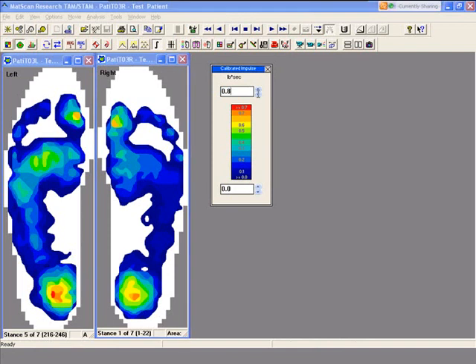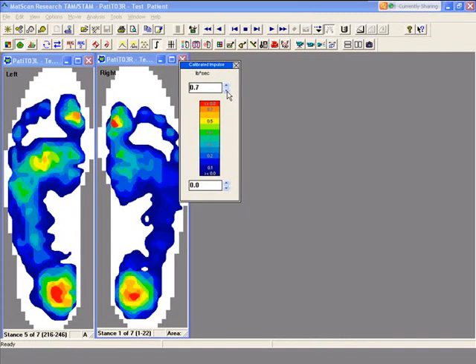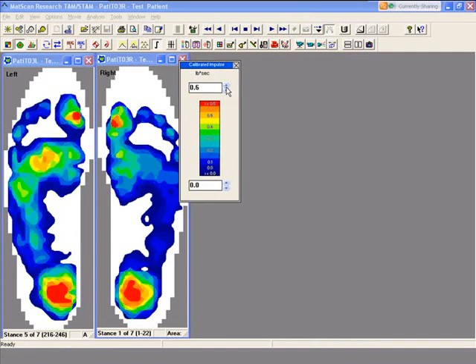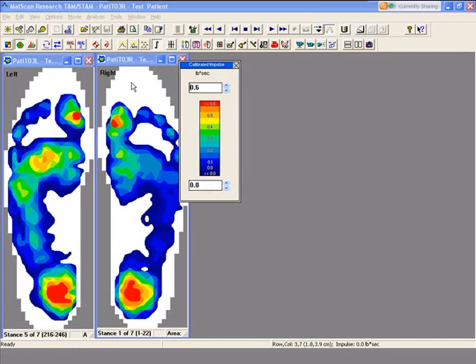This is showing you the areas that the subject spends the most time on. You can see that the subject spends a lot of time on the heel as well as the hallux.